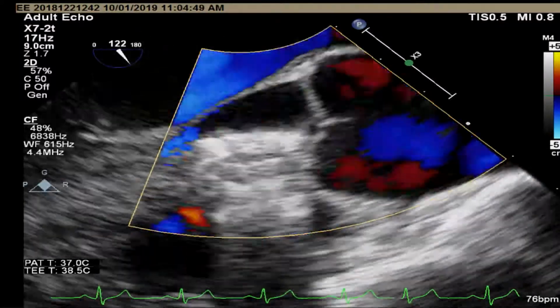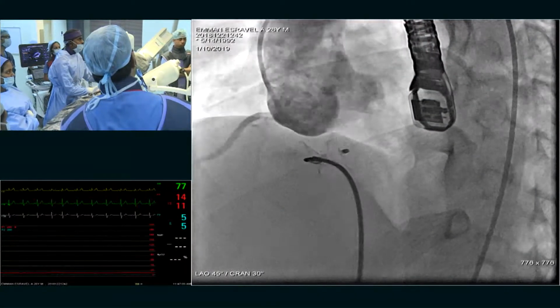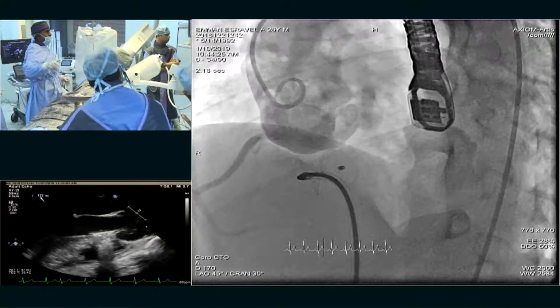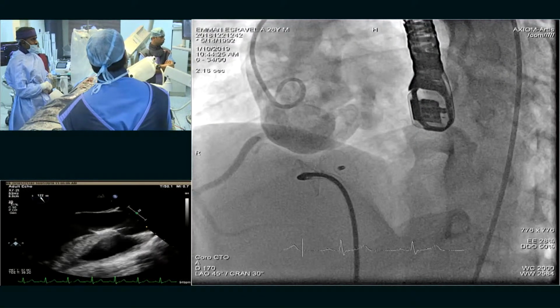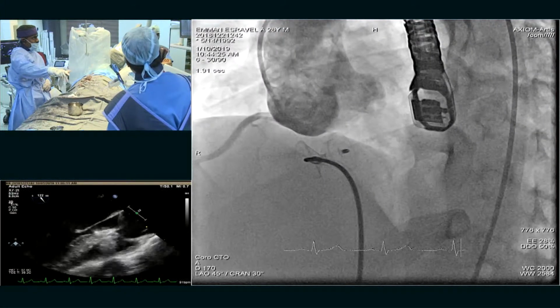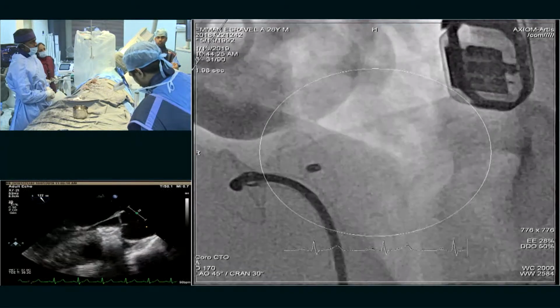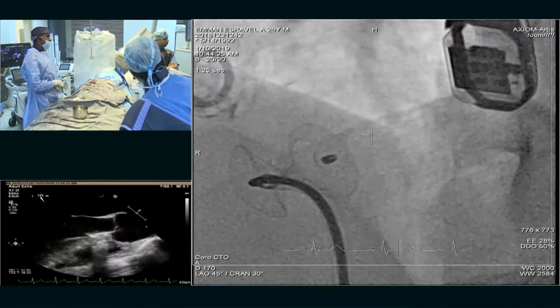So go live on angio. So that is the angiogram. Freeze it. Okay. Just go back. Make the valve open out. Yeah. Keep on going. Go next frame. I think there is a small gap there. Mag, one more mag on this. Yeah, just move the frame. Go back.